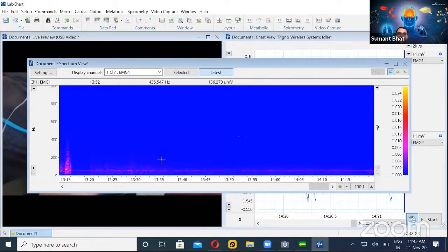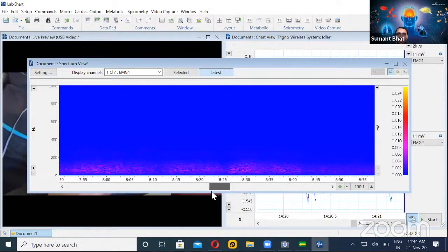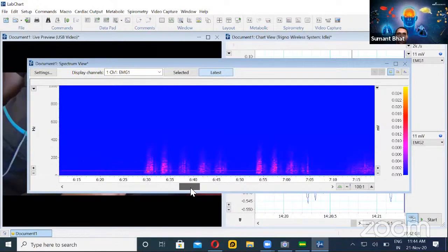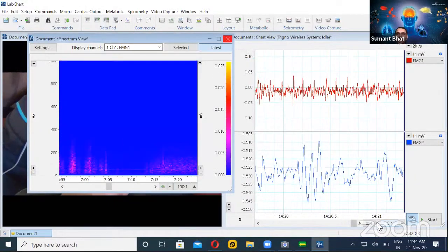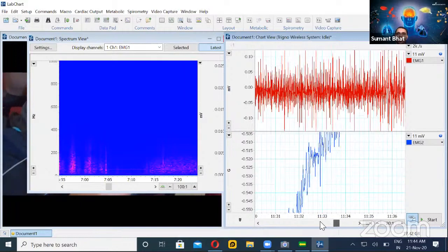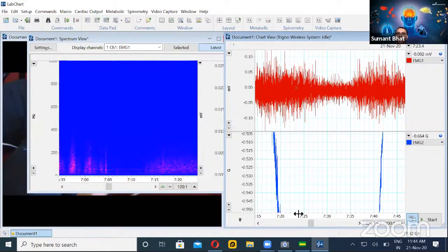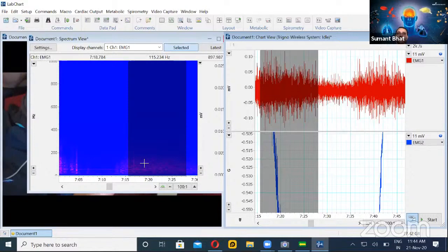There seems to be some delay, so meanwhile I'll show the previously recorded waveform. Just scrolling a little back — it is already showing some color shades. These color shades represent the value or amplitude during contraction. If I scroll back and select an area of the contraction, you can actually see the frequency components of it in the spectrum view at the same time.